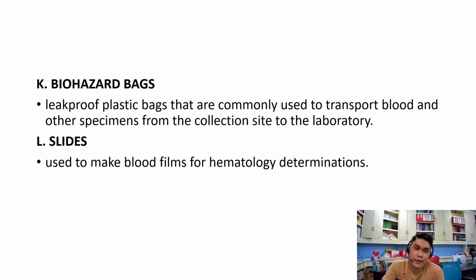Then next, biohazard bags. These are leak-proof plastic bags that are commonly used to transport blood and other specimens from the collection site to the laboratory.